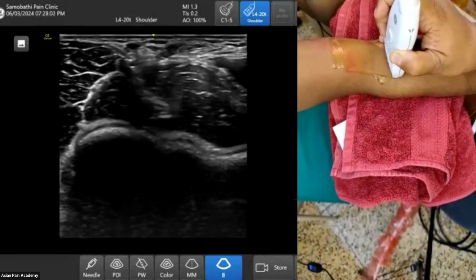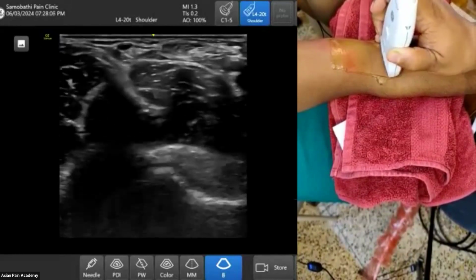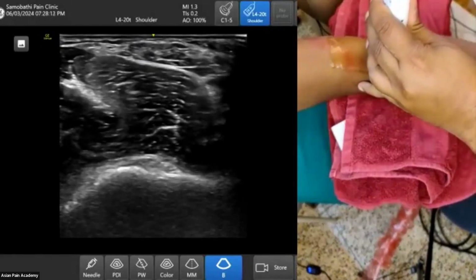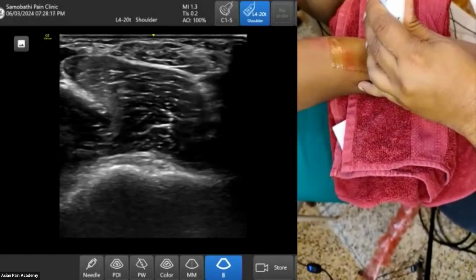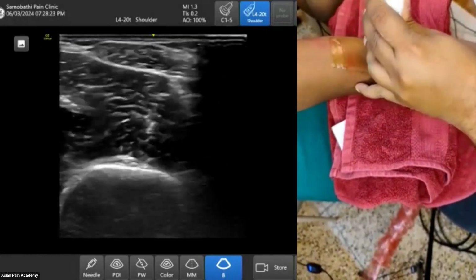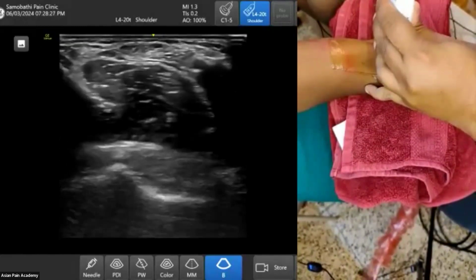Okay. So in this picture, one thing is very clear. Initially, what muscle are we seeing as large? Let me focus. This muscle here was very large at this point. As we move up, it will be much larger above. But as I come down, this muscle is becoming very small, and this is the biceps.